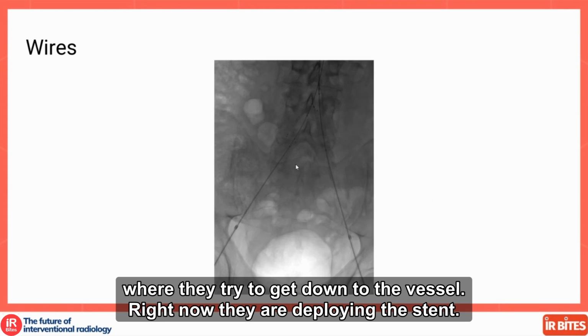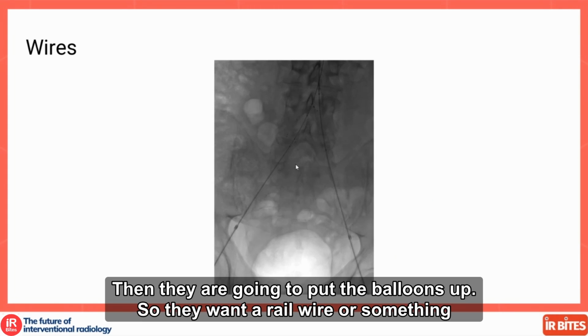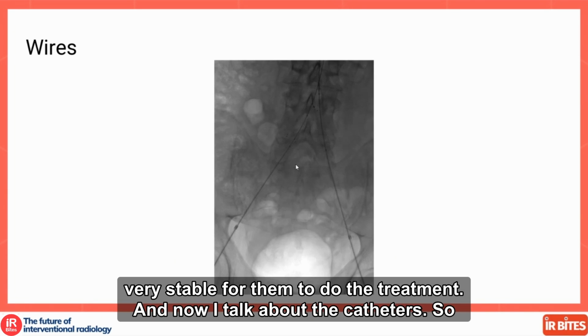Now they are deploying the stent. They are going to put the balloons up. So they want a rail wire, something very stable for them to do the treatment.